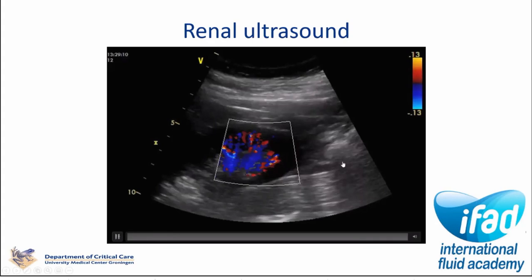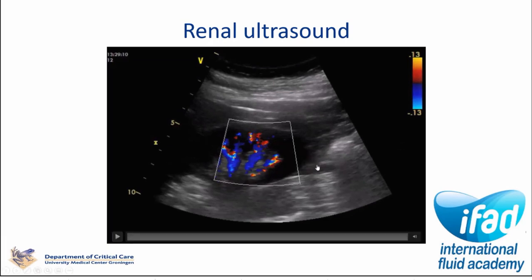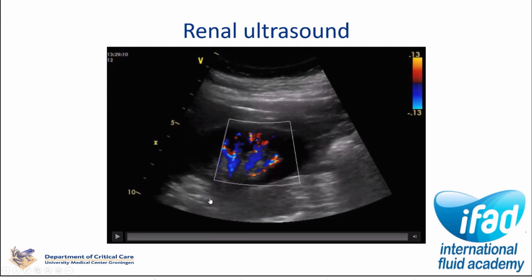And last but not least, we have renal ultrasound, which you can use to both exclude hydronephrosis, which I will get back to later, but also to see and envision the renal vasculature. In this image, you can perform various measurements, of which most have been on the arterial function, the renal resistive index, but most recently, some new studies have shown that the venous impedance index, so actually showing the pressure differences in the renal veins, may also predict acute kidney injury. The latter has more connection with the concept of venous congestion, of course, because it translates back to the higher pressure, for example, in the vena cava and in the right ventricle.